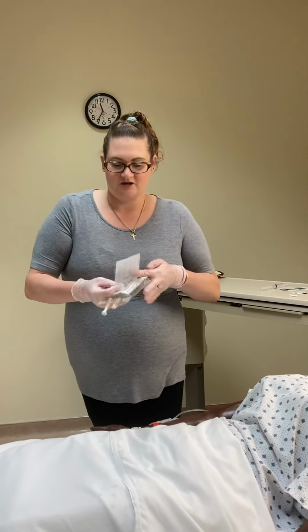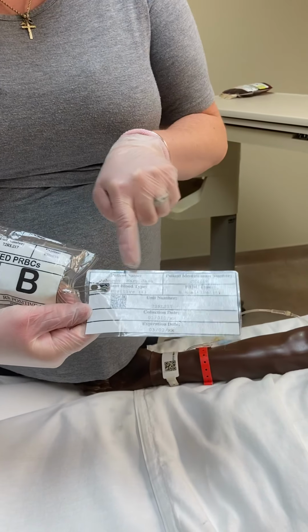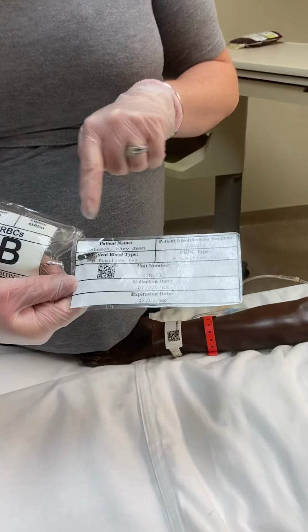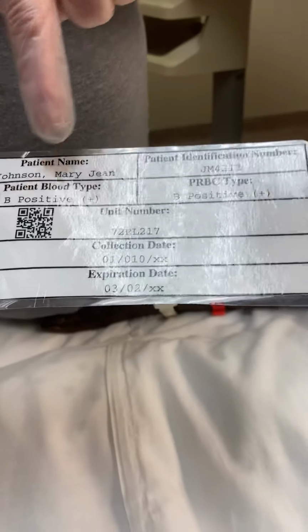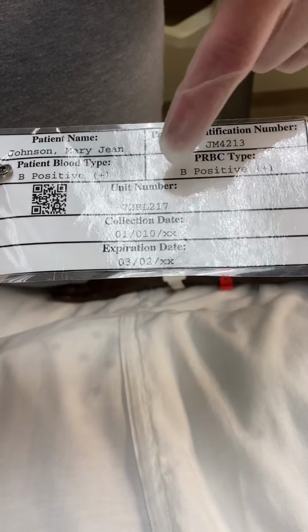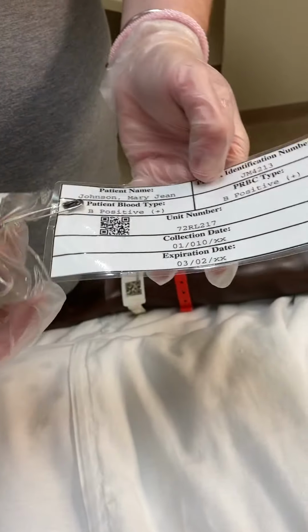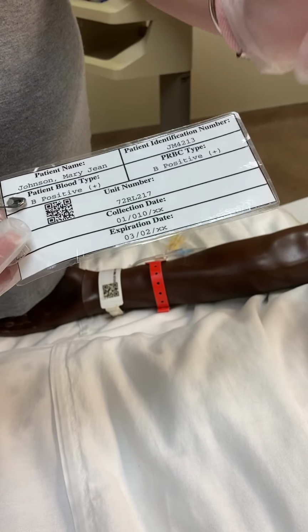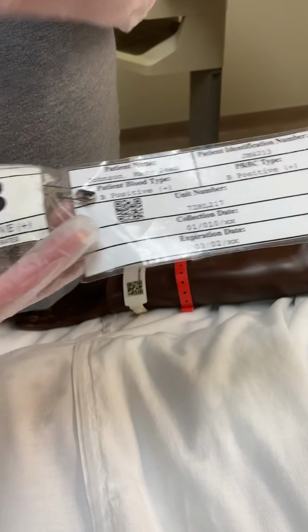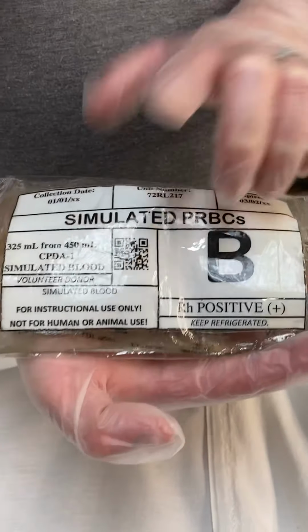But we're going to use our lab made one here, which shows my requisition here for Mary Jean Johnson. Her patient identifier, the type of blood is B positive. For her type, the type that this is B positive. The unit number, when it was collected and when it is expired. And then there's usually somewhere that says how many mLs are in there, roughly.